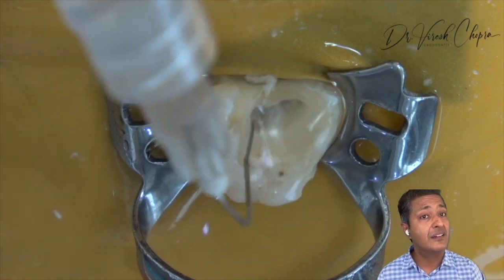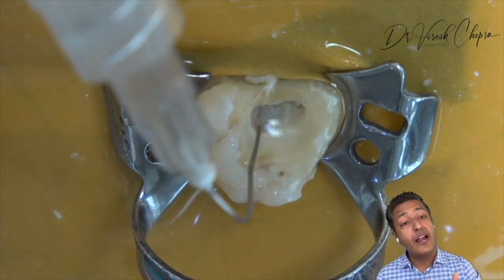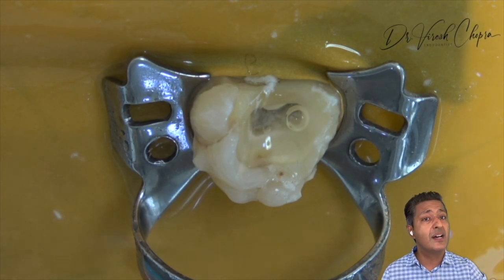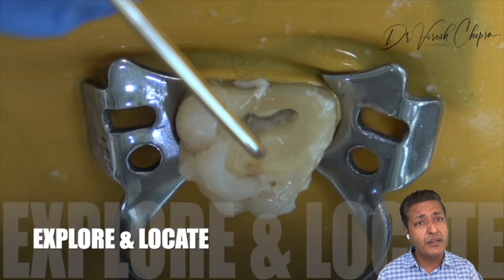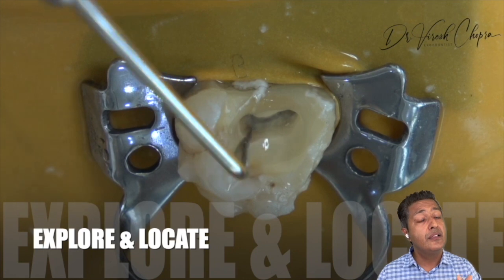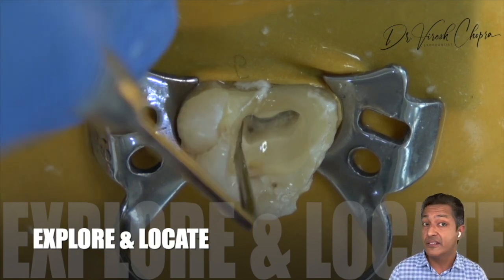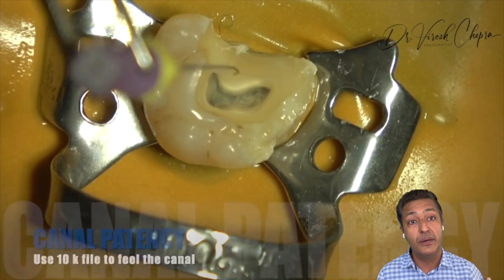And once that is confirmed, that is basically the boundary, the peripheral extent of that particular wall for the access cavity. So we don't need to extend. Once that wall is done, we need to do every wall like that. And once we have clear visibility where all the axial walls, enamel, dentine, the junction of the pulpal floor to the axial wall, all are in one line, that is the peripheral extent of the access cavity. And this is where we don't need to do any cutting with the bur anymore.